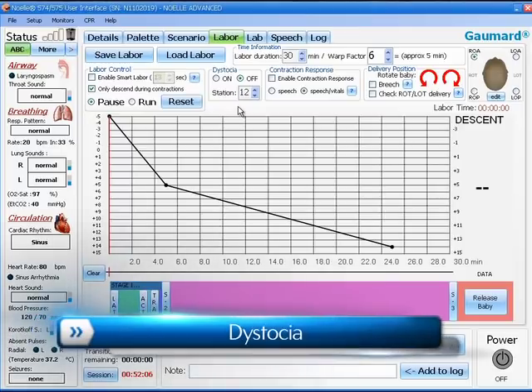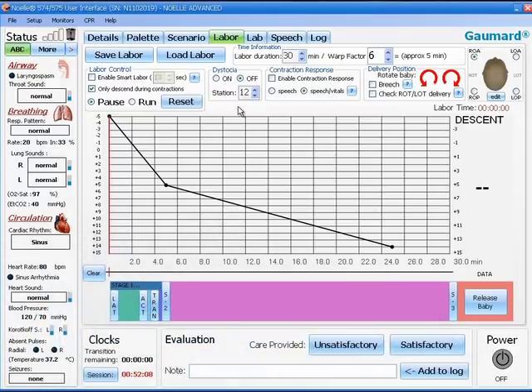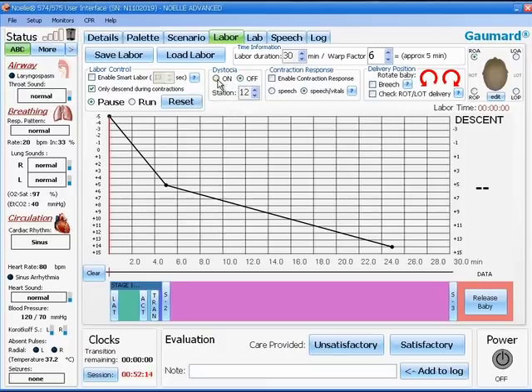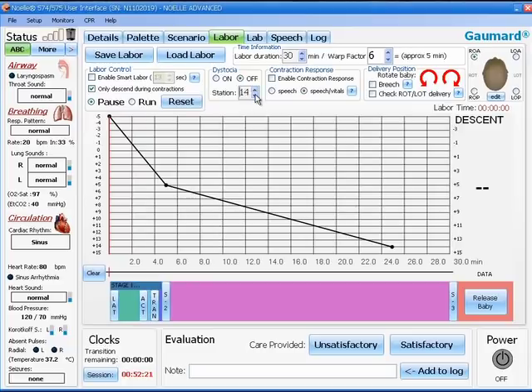The next box is your dystocia control. As you can see, you can turn dystocia control on or off, and you can set a station of where you wish the dystocia to occur. The higher the station number, the further out the baby's head will be when the dystocia turns on.